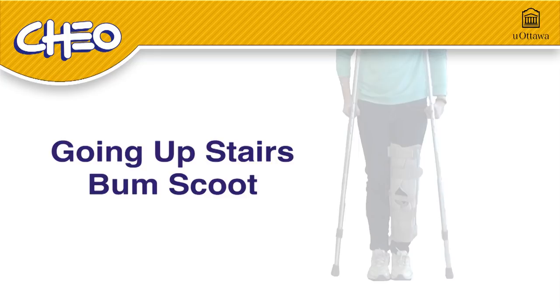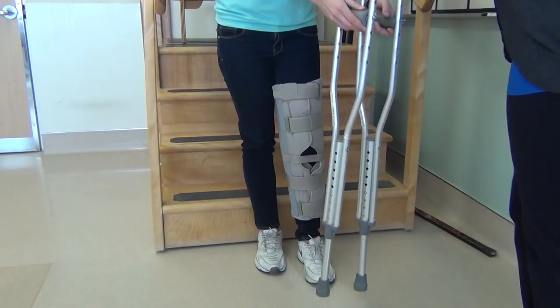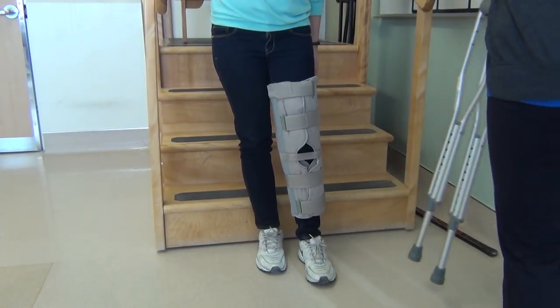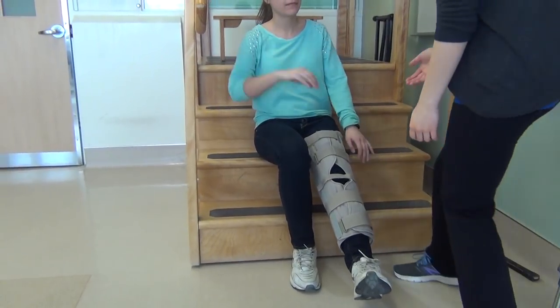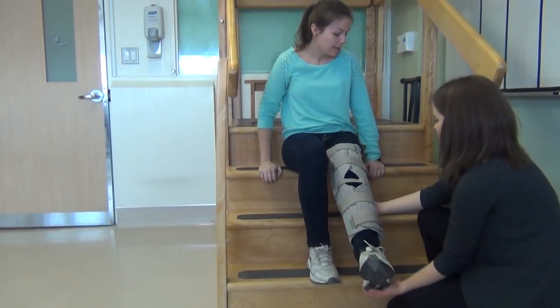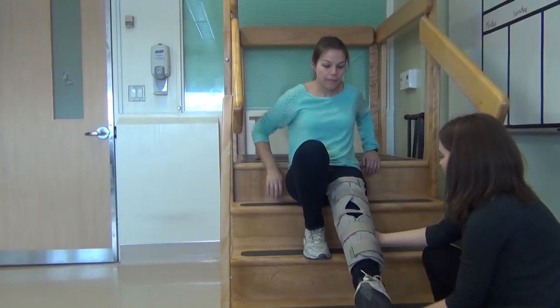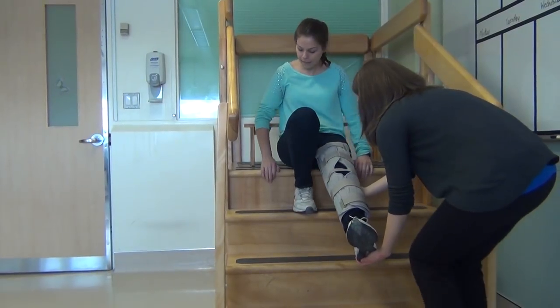Going upstairs — bum scoot. In some cases, it's safer to go up and down the stairs on your bum. Give your crutches to an adult to bring up the stairs for you. Lower yourself carefully to the highest step you can comfortably sit down on. Put your hands on the stair above the one you are currently sitting on. Put all your weight on your hands and your good leg. Have an adult support your injured leg all the way up the stairs. Don't place any weight on your injured leg.